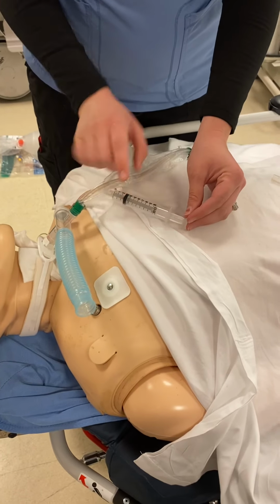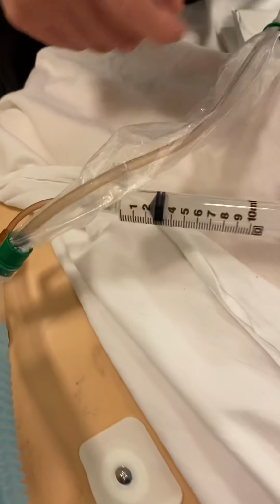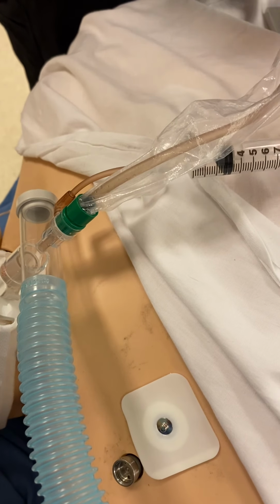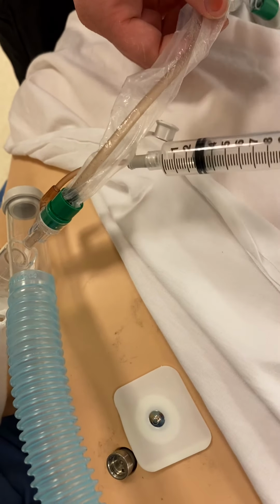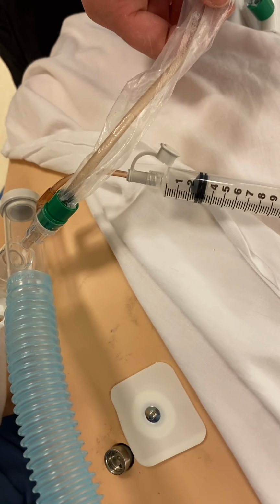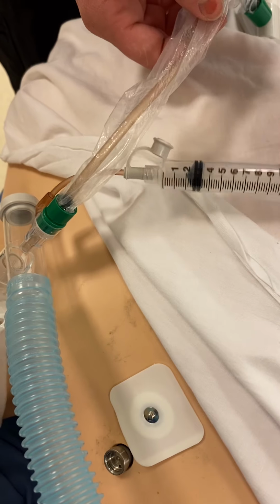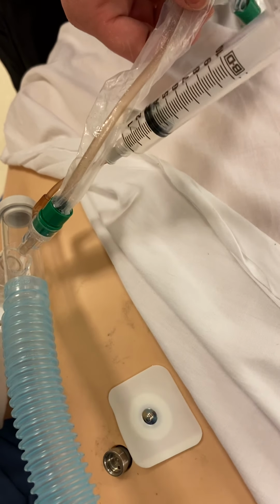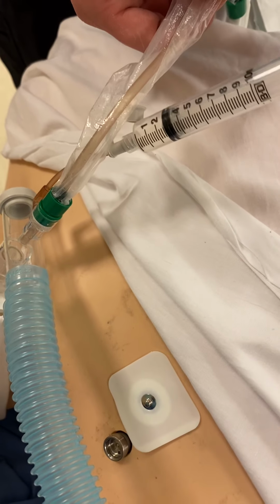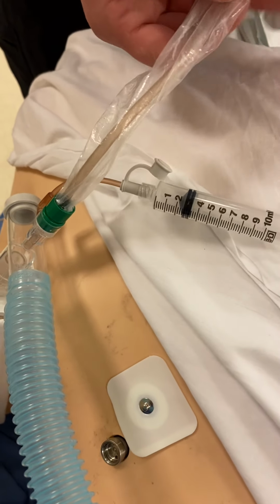Sometimes it will have a syringe on. That is to kind of break up any thick secretions in there. You do not have to flush routinely every time you suction. Sometimes if you're having a hard time or it's really thick coming out, you can inject 1 to 2 cc's of fluid. But remember, anything you're putting into this line is going into that patient's lung, and so you want to make sure you're getting all of that back out.